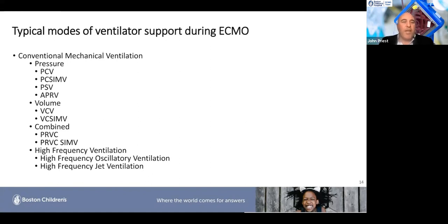And I do understand there's a lot of studies that show this is detrimental in neonatal and pediatrics. But in combination with ECMO, utilizing sweep gas and CO2 gas exchange, you don't need the releases as often as when not on ECMO. So in my mind this would be a good mode for lung rest as well as lung recruitment.